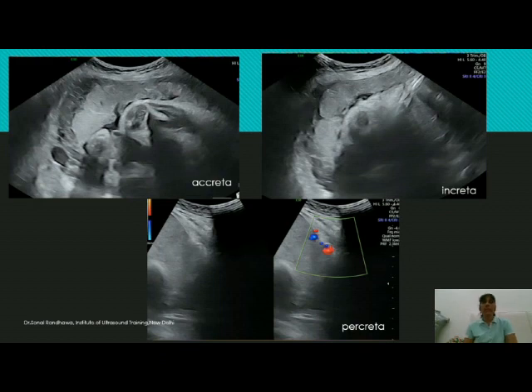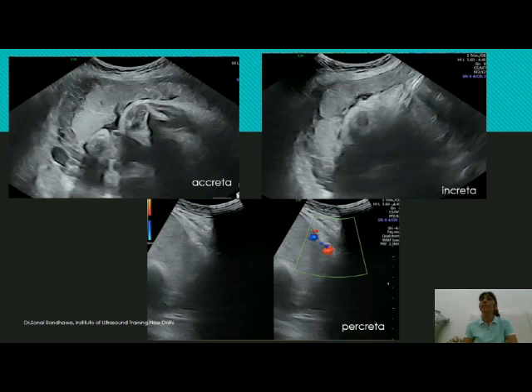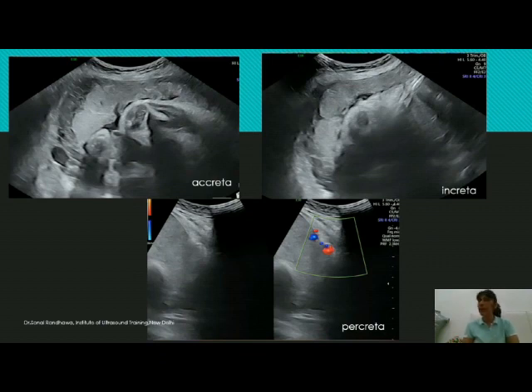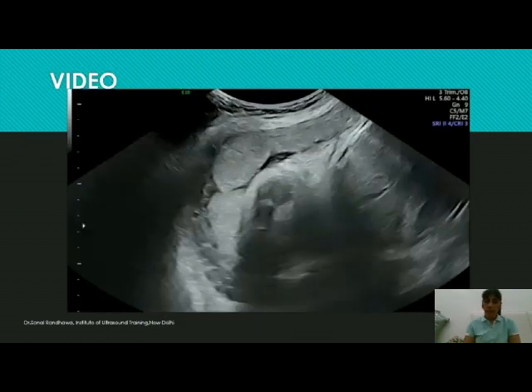This shows the great significance of assessing the retroplacental space — it should be part of your routine obstetric scan. Be especially careful in patients with a previous cesarean who have an anterior, low-lying placenta overlying the scar area, where the risk is high. But that does not mean you ignore other patients; all obstetric scans should include the protocol of confirming that the retroplacental space is uniformly seen throughout, so you will not miss a case of placenta creta.